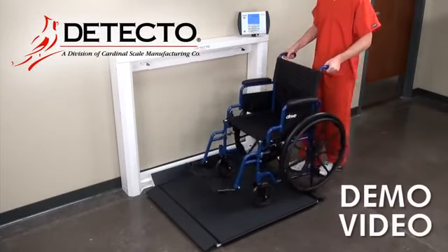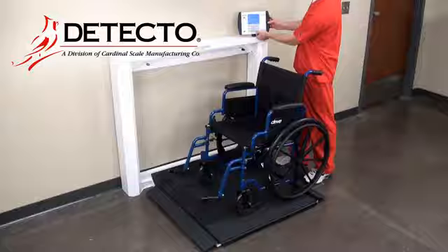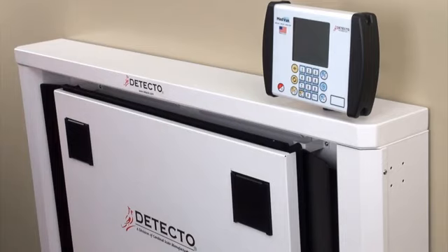Detecto's USA-made Model 7550 wheelchair scale features a unique fold-up storage design that conserves space when not in use. The 7550 easily accommodates most wheelchairs and yet takes up very little floor space when folded up.